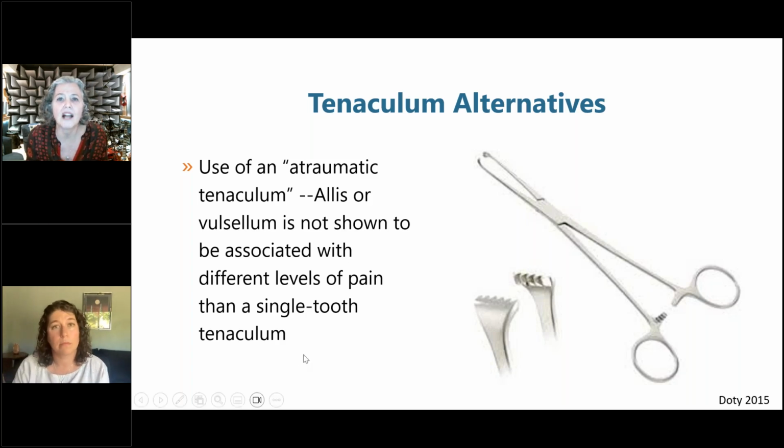So while you're trying to sop up blood with scopettes, or if some people even go to silver nitrate or Monsel's, both of which can burn, they're both caustic agents, really not to go down that path. Unless the person has, for some reason, pulsatile blood coming out of the cervix, maybe you've cut very deeply. This really isn't likely to happen, but let's say it did and you needed to put pressure on it to stop it.